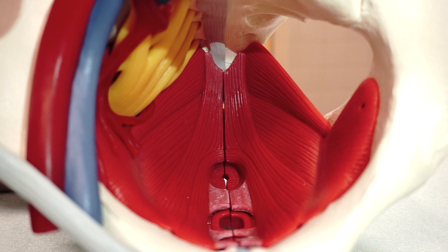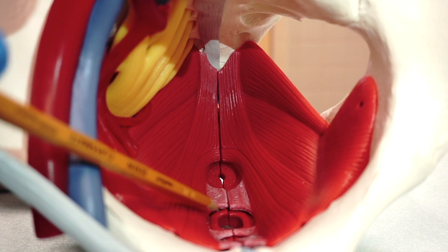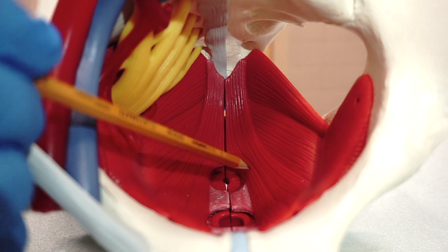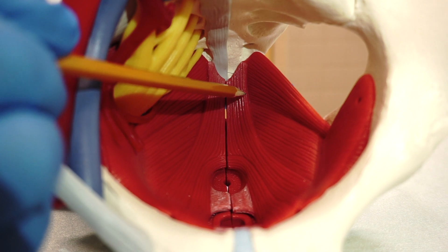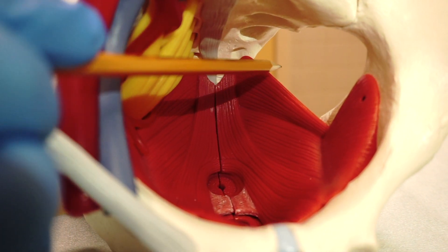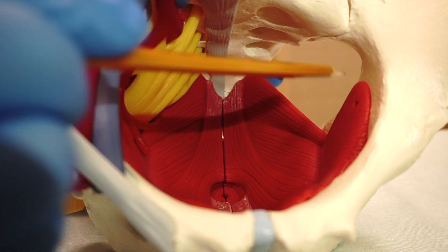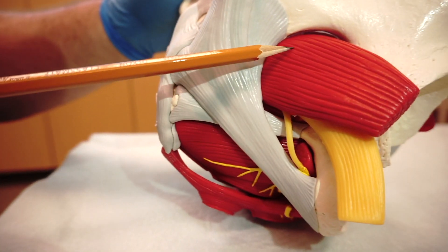The same muscles are demonstrated on the model: pubovaginalis, puborectalis, pubococcygeus, iliococcygeus, ischiococcygeus, obturator internus, and the piriformis muscle, which is demonstrated on this side. What you are seeing is a bird's-eye view of the pelvis.